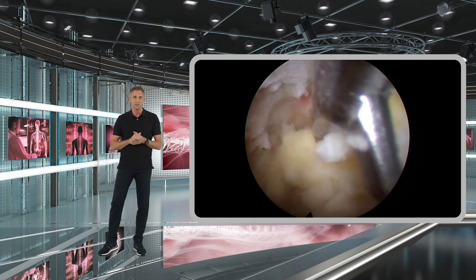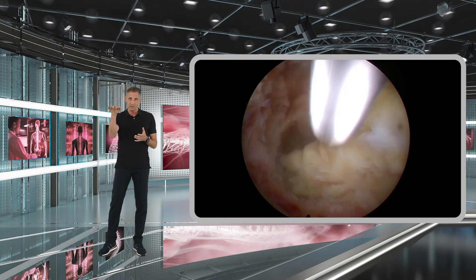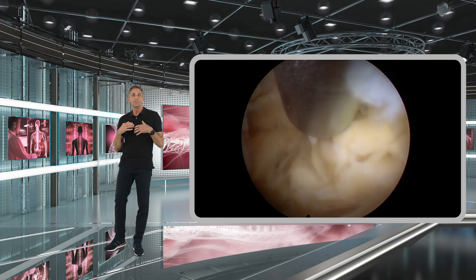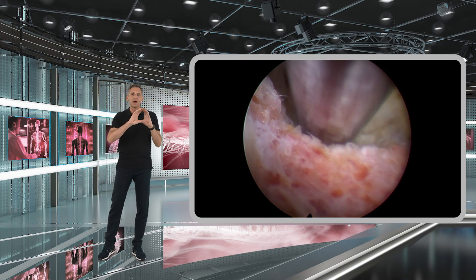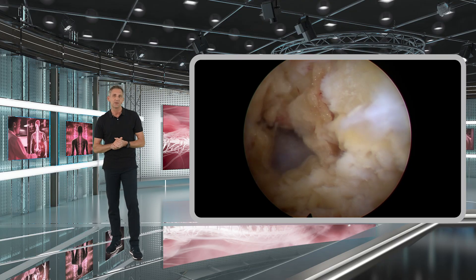Make sure that you resect the yellow ligament layer by layer — don't just cut a hole in one direction. By doing so, you can first decompress the central spinal canal and then later go more laterally to decompress the lateral recess.